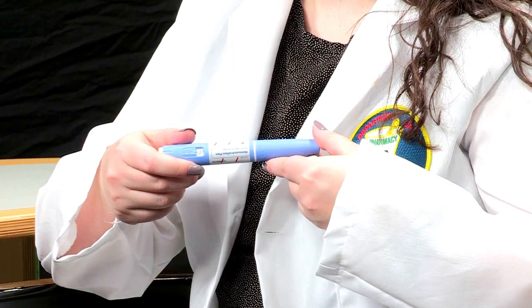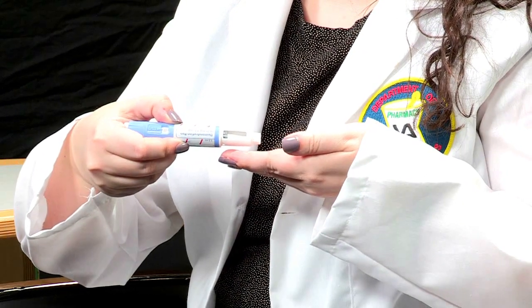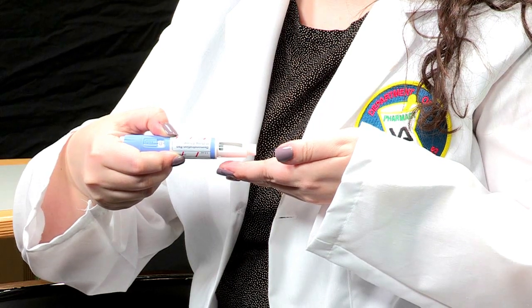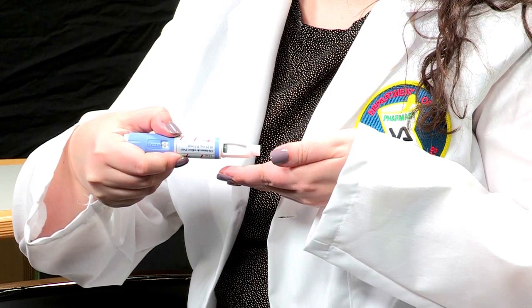Before starting the injection process, it is important to wash your hands with soap and water. Then double check the drug name on the side of the pen to make sure you have the correct medication. The first step is to take the pen cap off, then look at the medication in the pen window. You will want to make sure it is clear and colorless. If it appears cloudy or if it appears to have any particles in it or floating around, do not use that pen and contact your provider or pharmacy right away.